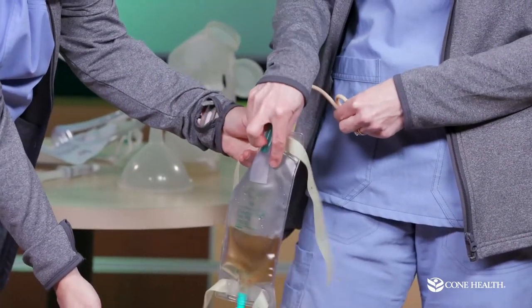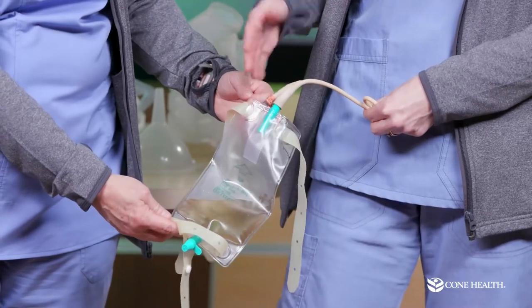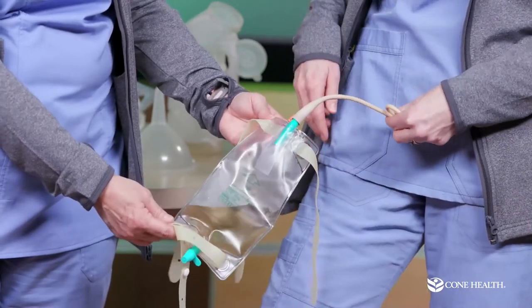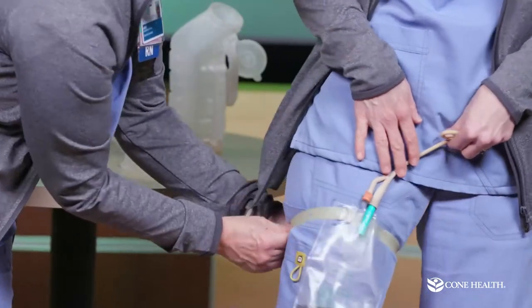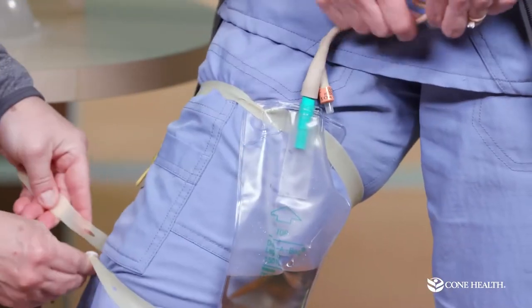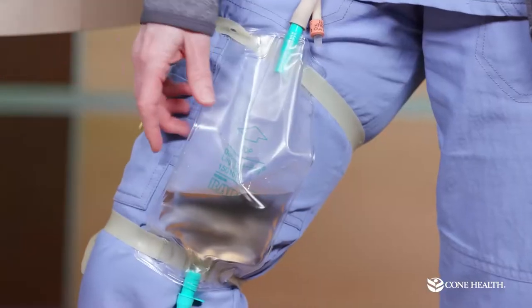When attaching the leg bag, make sure the rubber tubing goes behind the spout — if it goes over the spout it can press into your leg and cause indentation. Snap the bag's buttons closed on the leg strap, making sure it's on the inside of your leg. Leave some slack so moving around won't tug on you. The bottom strap is optional — it's just extra security.